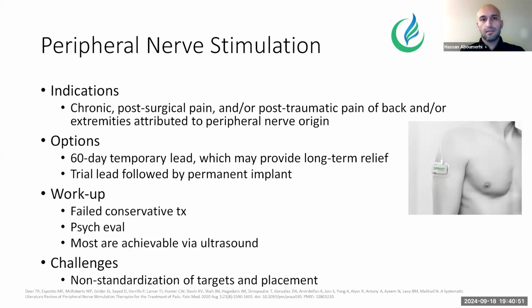In this case, there's kind of two options. One is a lead that's actually just placed percutaneously through the skin. I try to do most of these under ultrasound guidance. And it stays in the body for about 60 days, providing therapy. And then the studies show that the patient can continue to get pain relief for a year or two out after that.